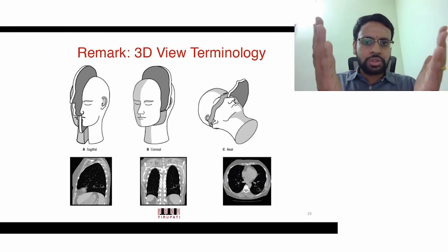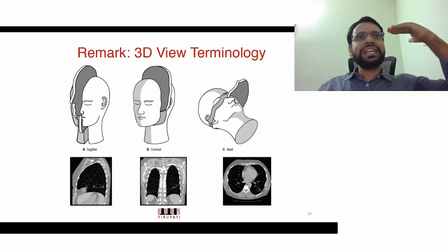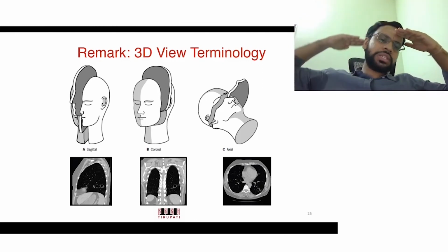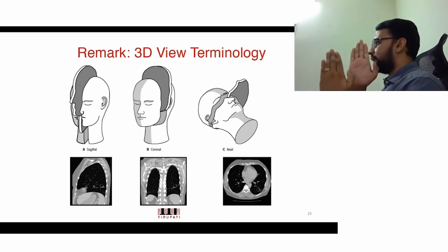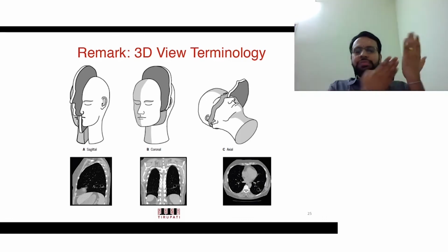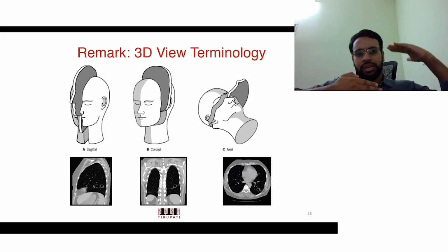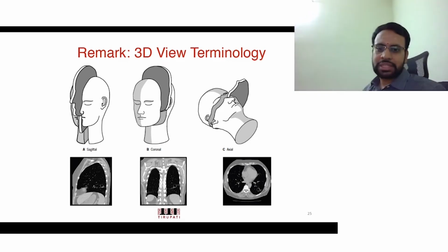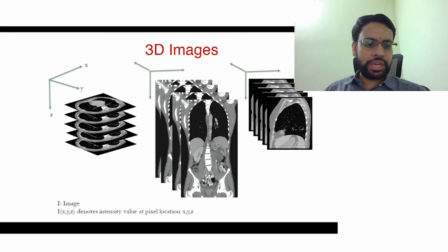So essentially you want to see 3D. For that, the information you see in 2D images, if I could put it so, axial is something like this slice. For example, if you want to see the brain here, usually this is referred to as the axial orientation. If you are looking from this viewpoint, this is sagittal. Coronal is you are looking in this direction. So you are looking at slices in this direction. If you are slicing me in this direction, as you could see in those images, this is coronal, this is axial, and this is sagittal. If you are looking from here, you are moving away, then that is sagittal. These are the three orientations in which you would be looking at images. This is, for example, images in these three orientations.